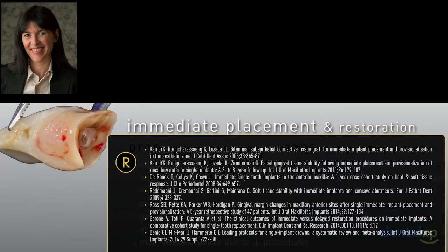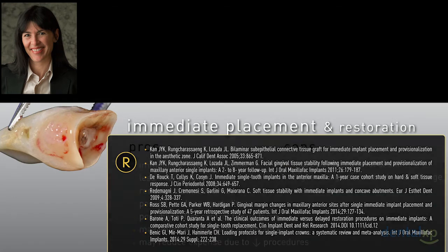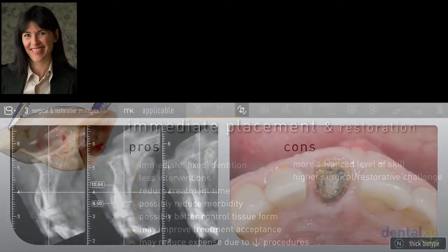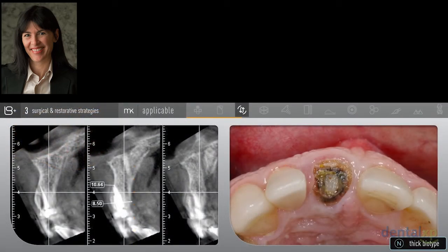If I can, I want to think about immediate protocols. I have lots of literature today to support these concepts. We know that these protocols are as effective and as successful as delayed placement and delayed restoration protocols. The reality is they're demanding procedures, though. All of us, when we get involved in more involved treatment, it puts a lot of pressure on us. There's a lot of demands in terms of the fineness of our work, the precision of our work, the communication amongst the team members. So when I think about immediate placement, I want to take you through a few cases to show you what's possible and to maybe challenge your thoughts here and there.